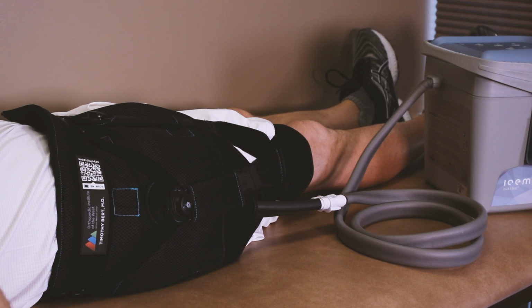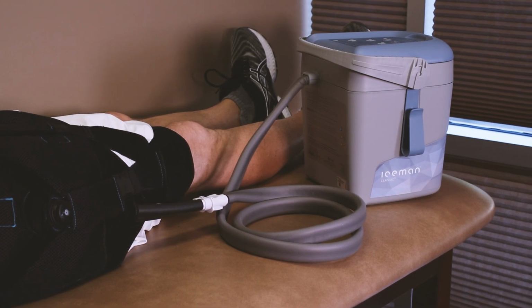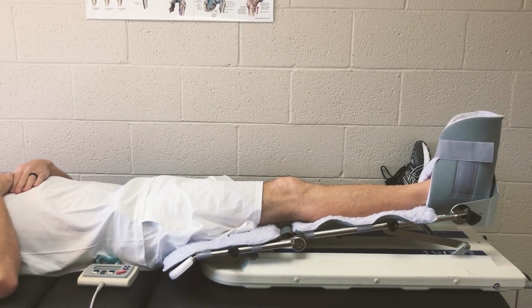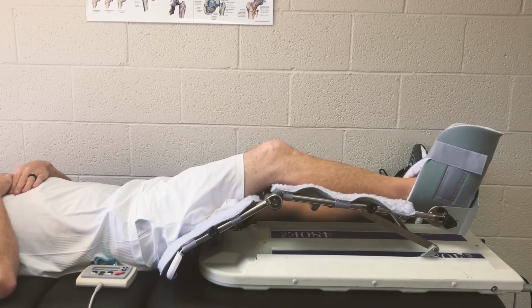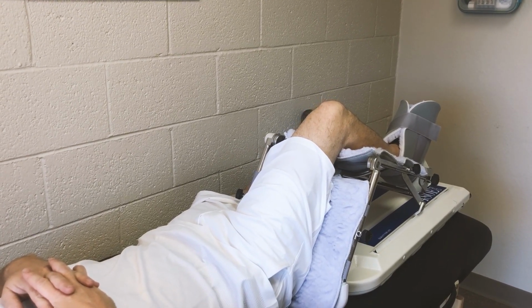Additional benefit of the brace is a hookup to a cold therapy unit, which we utilize to decrease swelling and pain, as well as eliminating the need for ice packs after surgery. This is key for decreasing the amount of pain medication you'll take after surgery. We also utilize a CPM machine in order to decrease the amount of edema or swelling in the leg immediately after surgery, as well as decrease the amount of scar tissue formation that can occur after a surgery like this, which can lead to revision surgery if this occurs. Another thing of the CPM is most patients aren't able to get into physical therapy the first 2 to 3 days after surgery, so it's a nice at-home physical therapist working on your hip from day one.